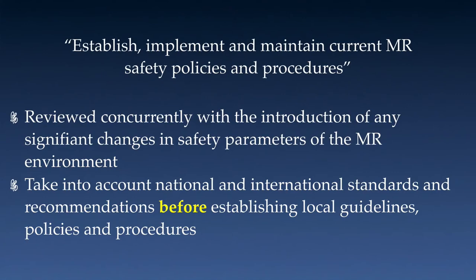Make sure they're current. You should also take into account any national or international standards and recommendations before you establish local guidelines and policies and procedures. It's always a good idea to stay in touch with the MR community to see if there have been any changes to standards or recommendations. And membership in the ISMRT, I might add, is a great way to do that.